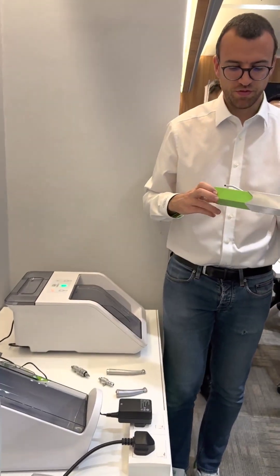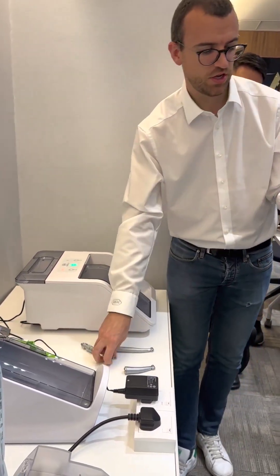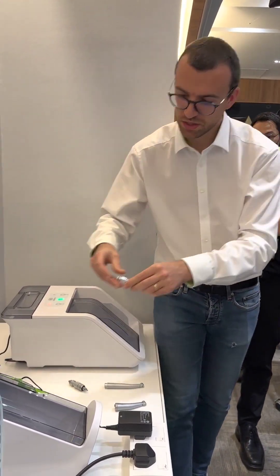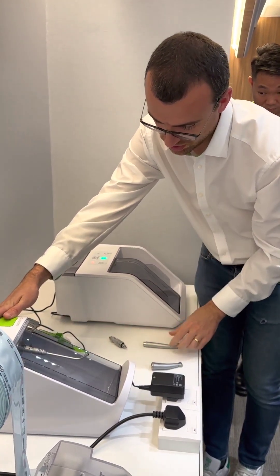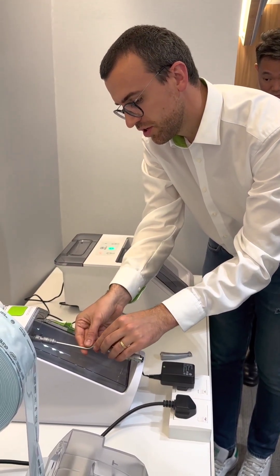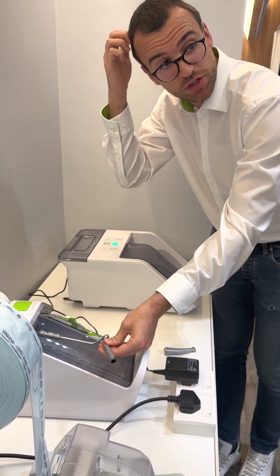Someone asked me about the chucking system — there is a specific adapter for the chucking system. In this case, you connect, place inside, and you have to use the hand pieces and the open door. It's the only case that works with the open door.